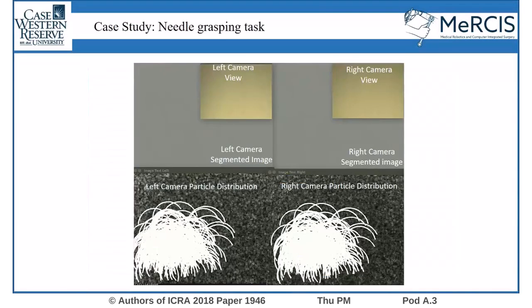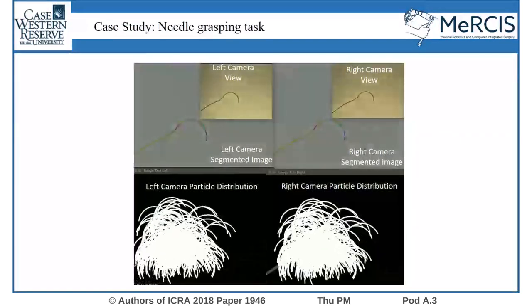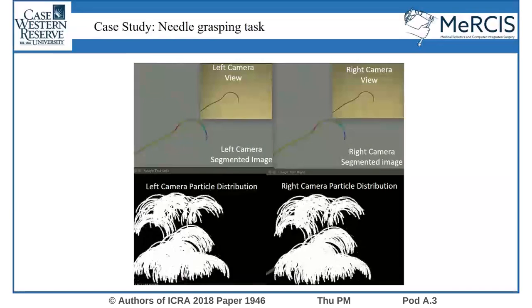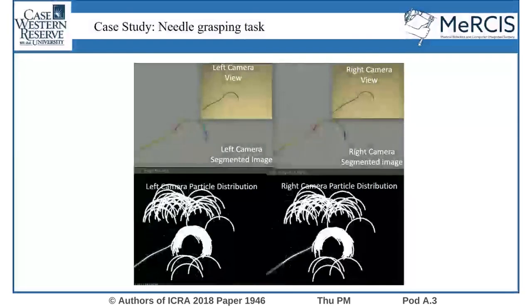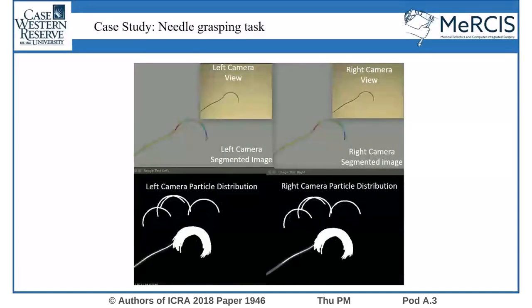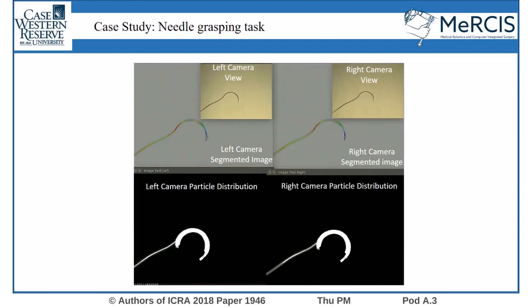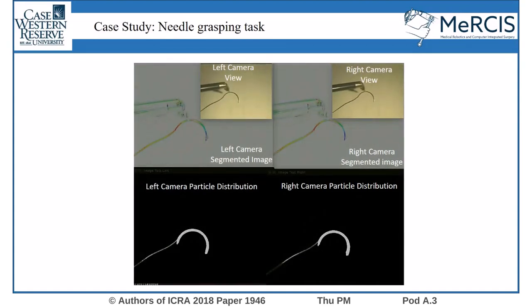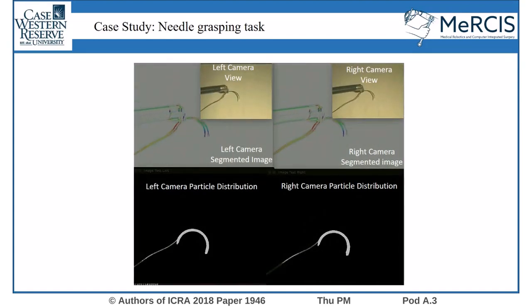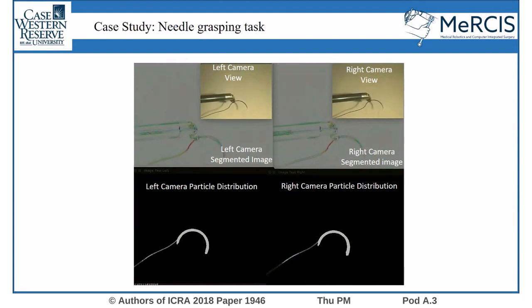As a case study, we performed an automated needle grasping task. The needle is randomly inserted into the endoscopic view. The particle filter algorithm detects the needle in the workspace, and once it converges to a solution, the needle location is sent to the robot for grasping.